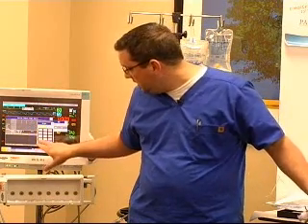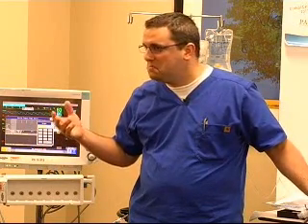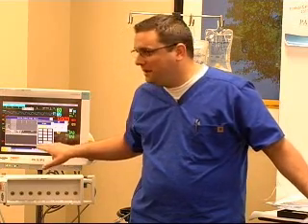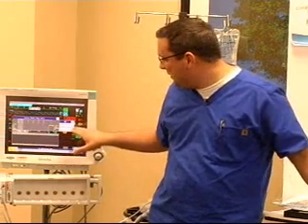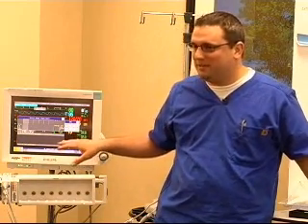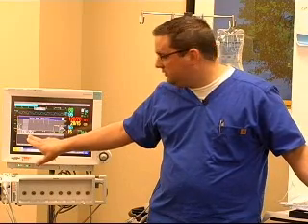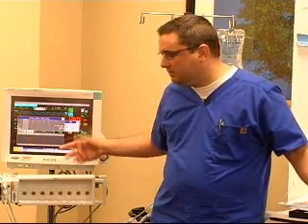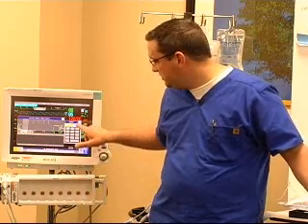So, okay? And so what's a perfect ideal patient weight? 150 kilos? 150 kilos. Pounds, okay, yeah. That'd be great. So we're 72 inches tall, so we're nice and tall, and we're 150 pounds, right? So anyway, that gives you your BSA. It automatically calculates it for you. And if you noticed, whenever I went to change that, I just tapped on the screen right where it says BSA, it comes up over here, and then we can put those numbers in. Same thing with the computation constant, okay? So it's easy to access.